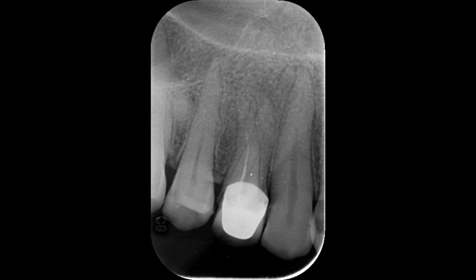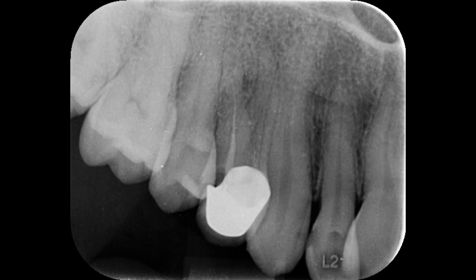Let me show you clearly with another view of the radiograph. Here you can see very well — this is the margin of the palatal root and this is the margin of the buccal root. Overall the complete job is unsatisfactory; this is not an acceptable root canal treatment.